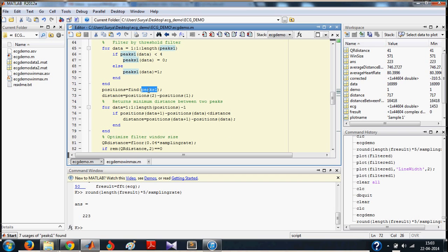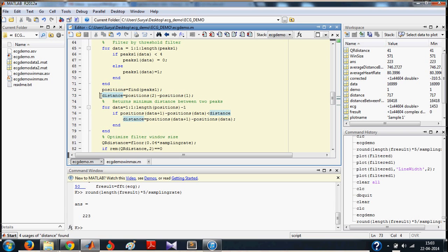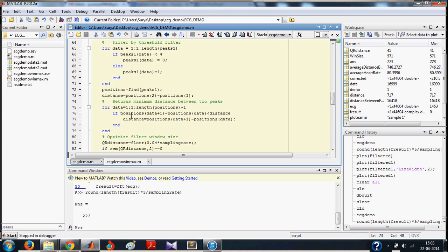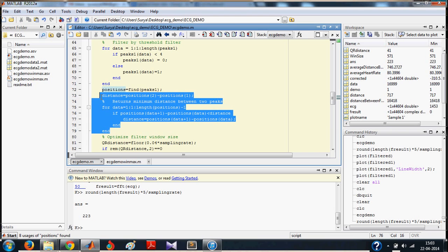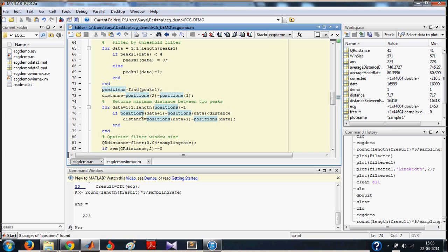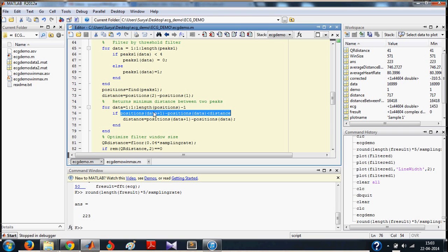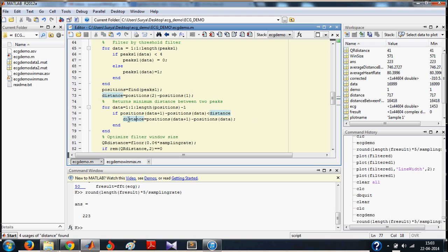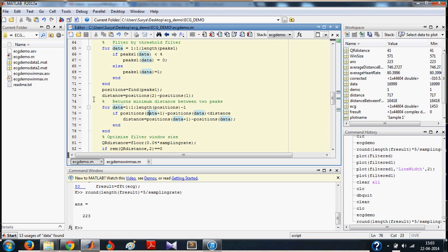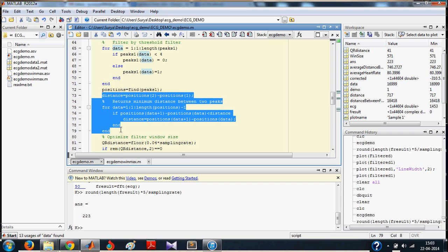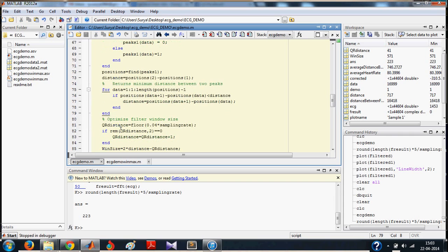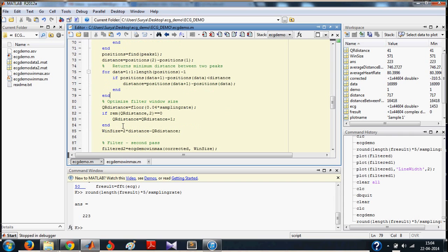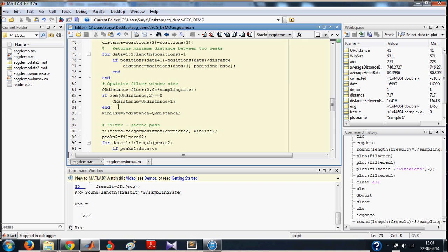You find the positions of peaks and save it in this array called positions. And you calculate the distance between peaks. At the end of this loop, each time inside this loop, you are comparing the distance between 2 corresponding peaks. And if it is less than distance, you make distance equal to the distance between the peaks. So what happens here is that you get the minimum distance between 2 successive peaks.